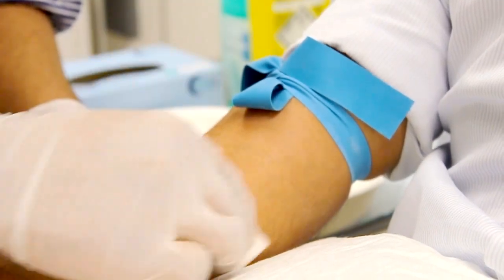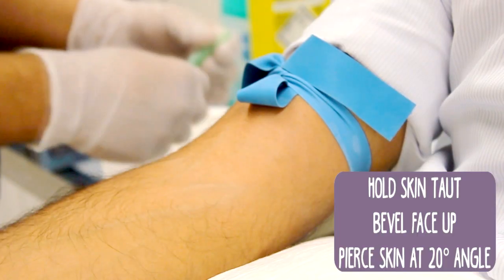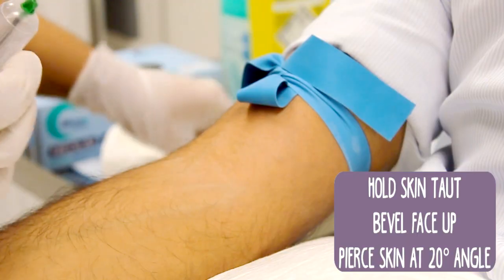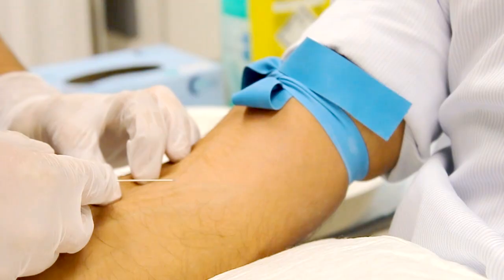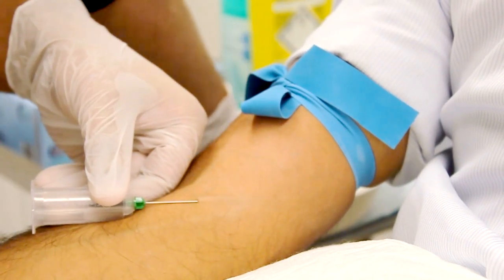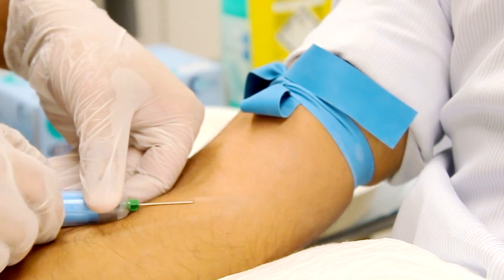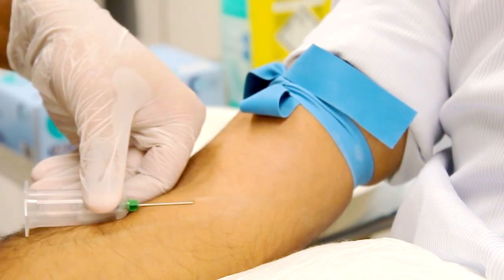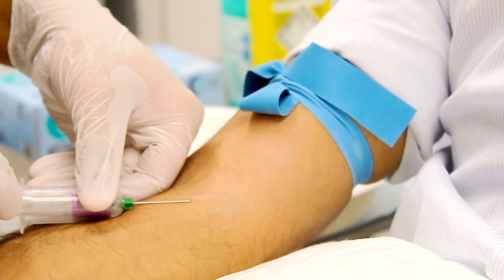Get your needle ready with the bevel side facing up. Go in at about a 20 degree angle, making sure that with your non-dominant hand you're holding the skin taut — this helps anchor the vein that you're going into. As you go into the vein you will feel it kind of give, and that is your cue to get the blood bottles ready and start taking your blood. If you're right handed, put them on your right side — make life easy and take your blood.